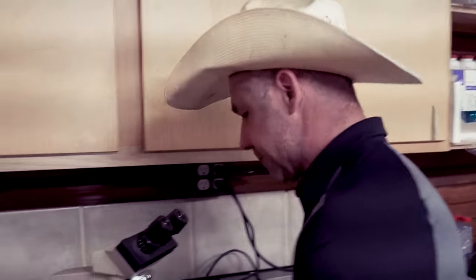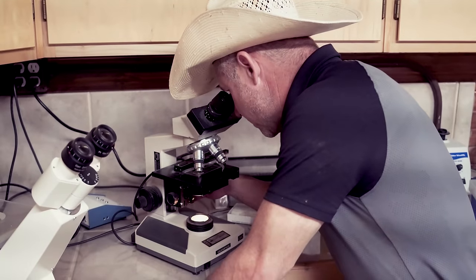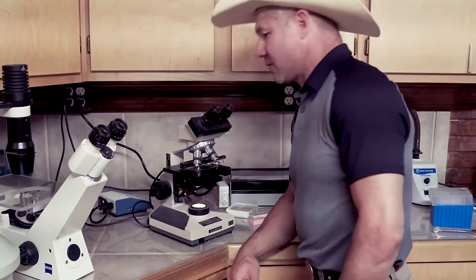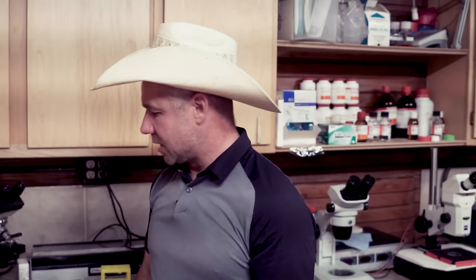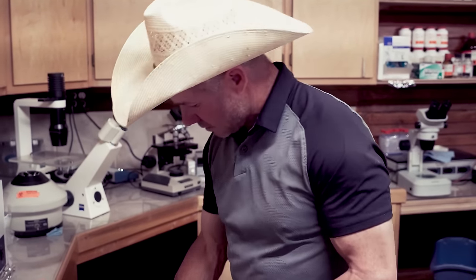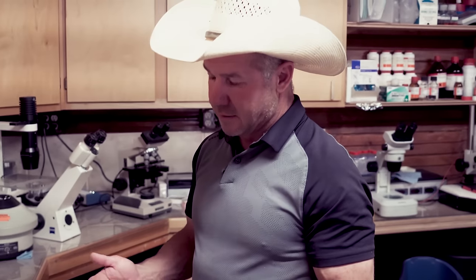So we're going to look at a percentage. Being his first collection of the year, not bad, not good. Swimming like this is considered dead. I just want what's going straight ahead. This is his first collection of the year, so he's got a lot of dead sperm in there. We kind of clean him out today, and then Wednesday he'll be a lot better. In 48 hours he'll clean up and be a lot better. So today I'm calling it 50% motility. Total mobile is say 7.5. So we could breed four mares today.